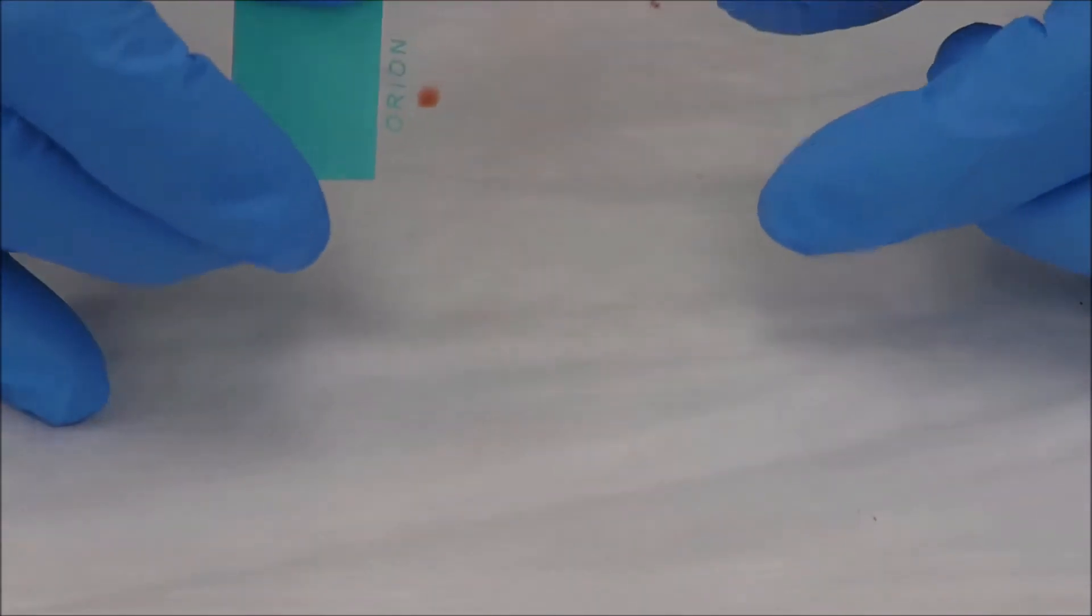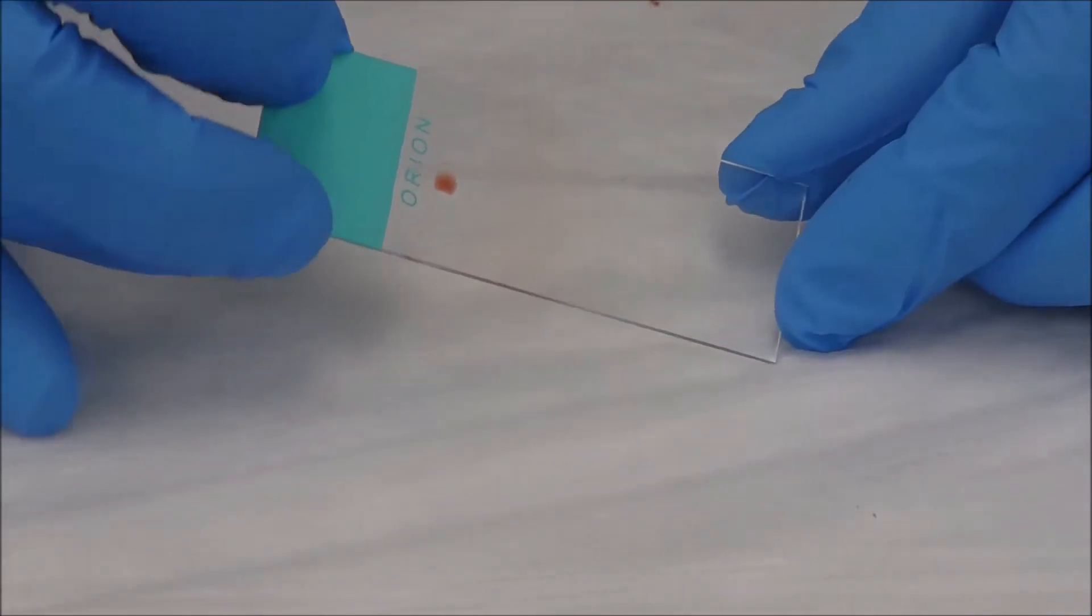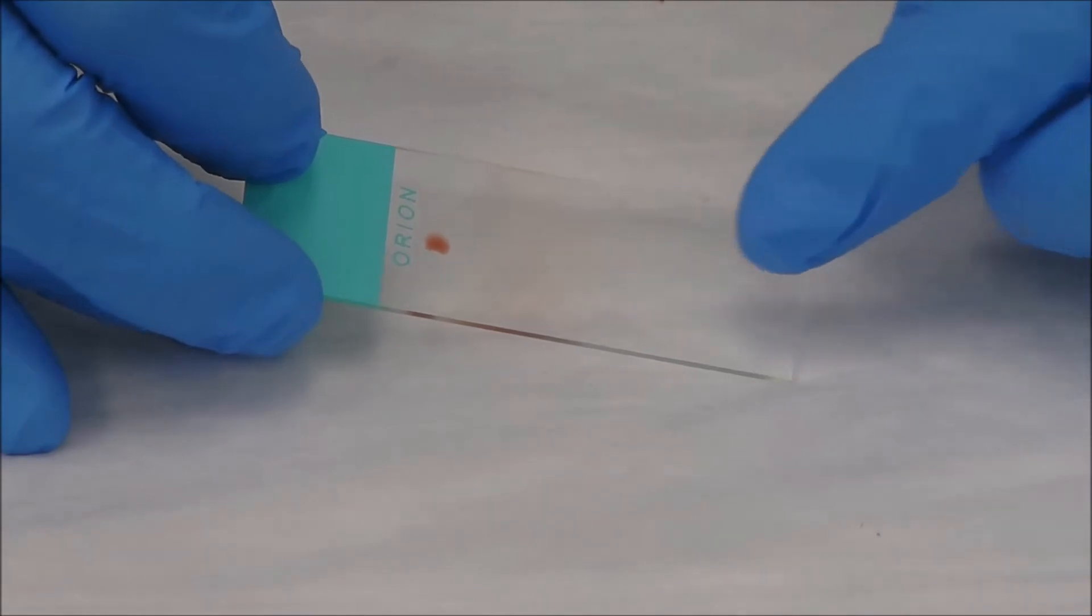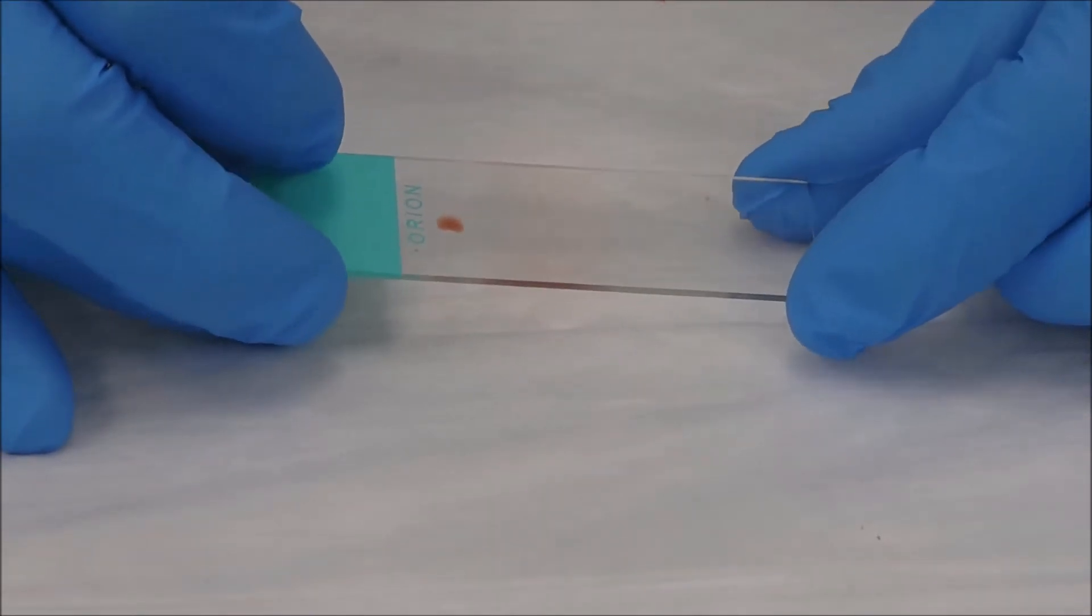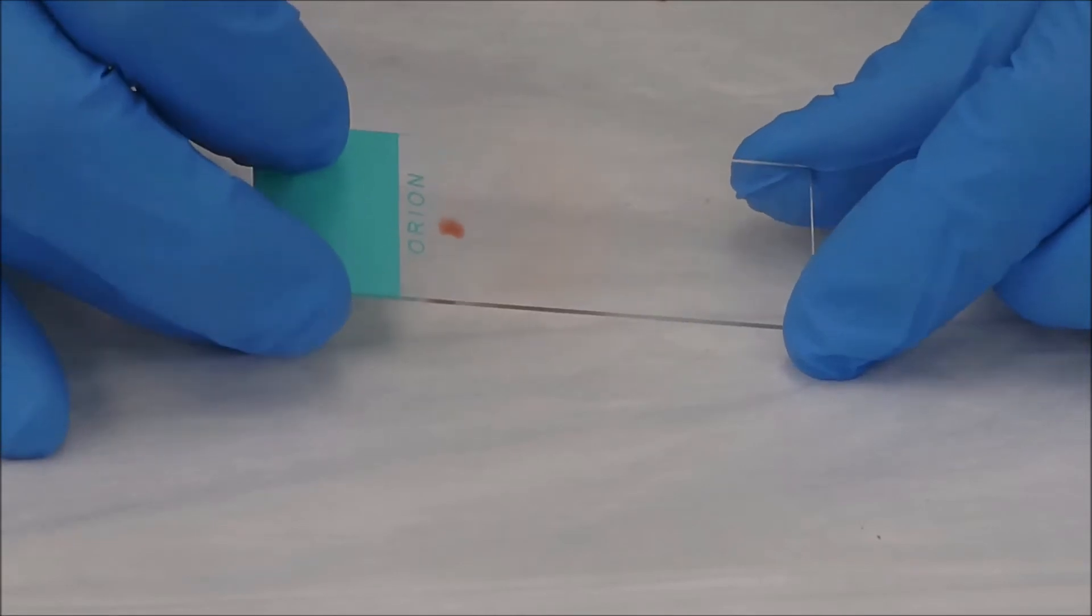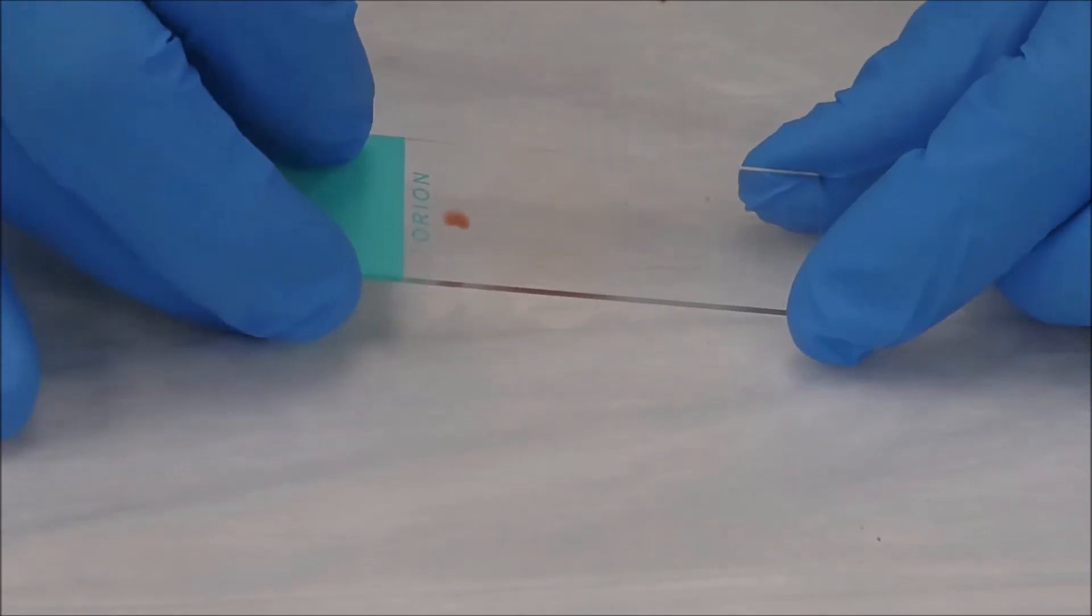Okay, so we've gotten a kind of short smear right there. So we're going to try to make a few other ones. We want the smear to go most of the way, about two thirds of the way down the slide, and then have a nice feathered edge. Because it's along that feathered edge that we're actually going to be counting the white blood cells. So let's try again.